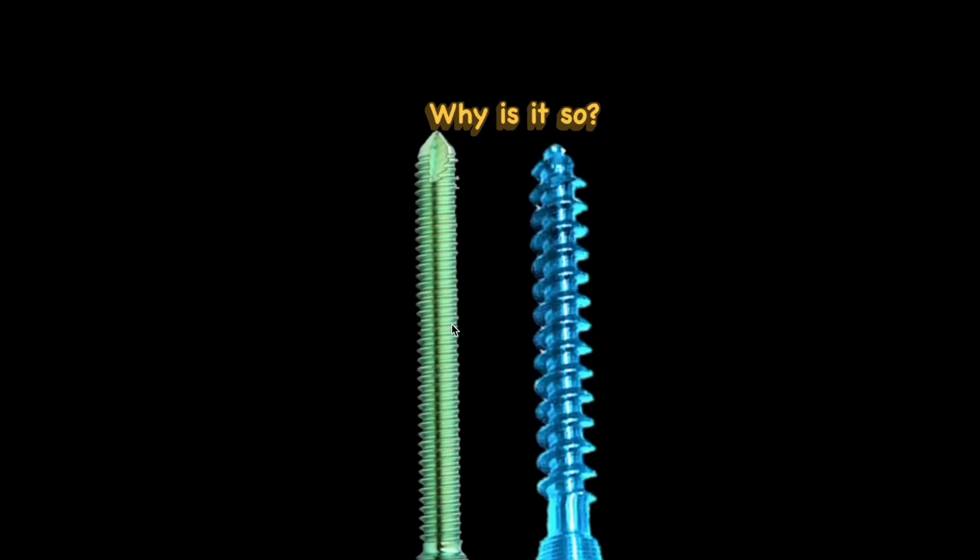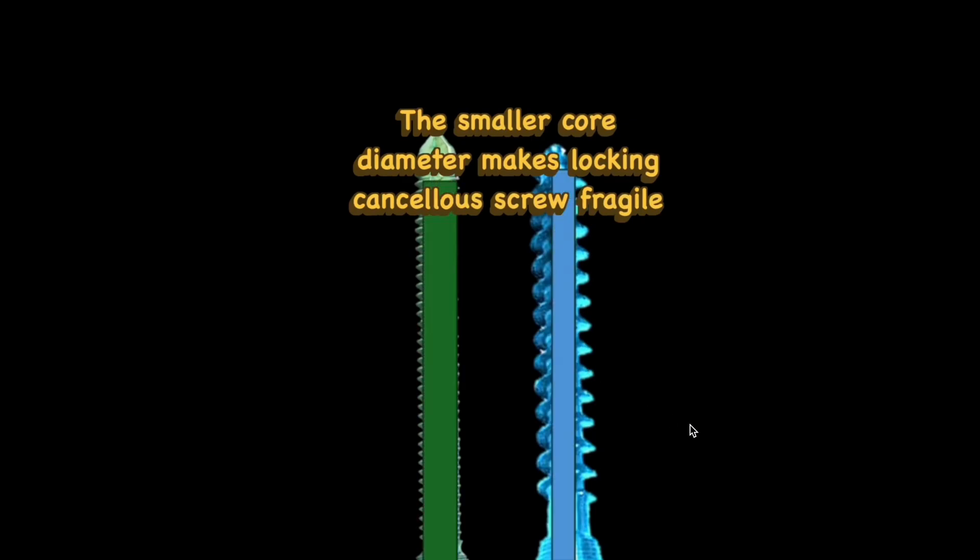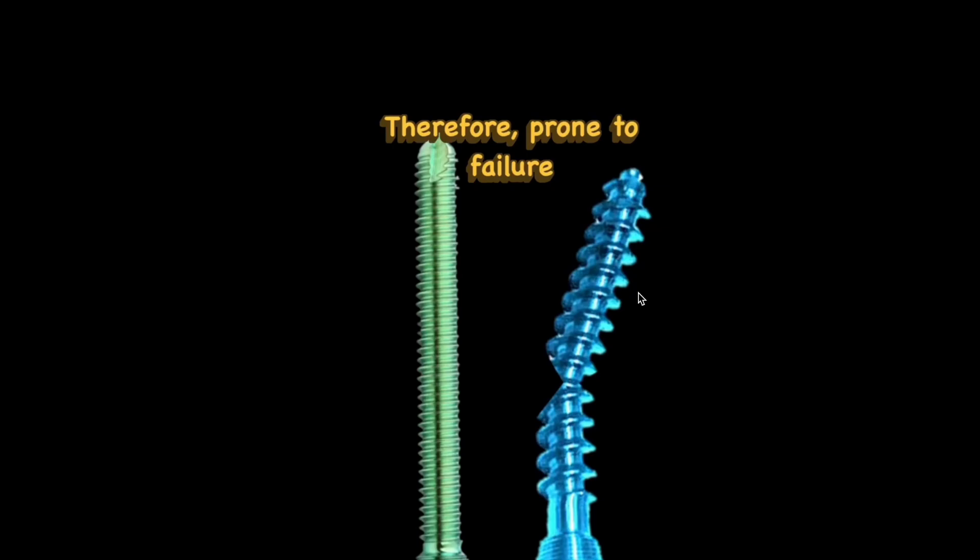Here you can see the shaft of the conventional locking screw versus the shaft of the locking cancellous screw. The difference is the core diameter — the smaller core diameter in the locking cancellous screw is because most of the diameter is occupied by the threads, the deep pitch. If you try to bend such a screw, it will tend to break; therefore, they are prone to failure.